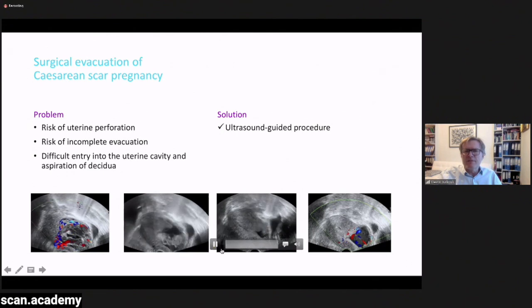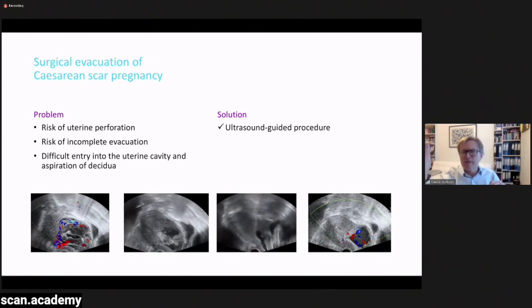When evacuation is finished, you will see how front of the uterus, the wall is very, very thin. It moves with the suction, but because you're not going perpendicular to the wall, you're just aspirating it, it's not going to perforate. So risk of perforation, if you use simple suction, plastic curette, is not going to be a problem. I must say, I never use metal curette in early pregnancy, and therefore this instrument is potentially more dangerous.